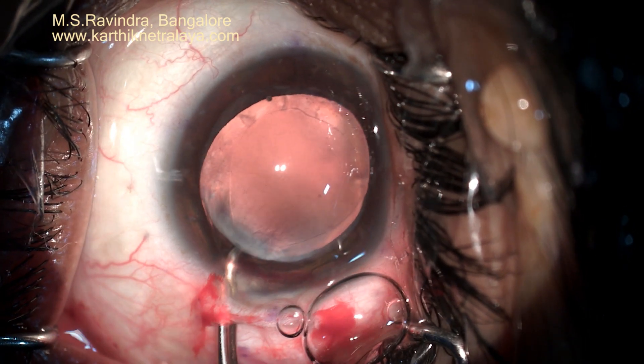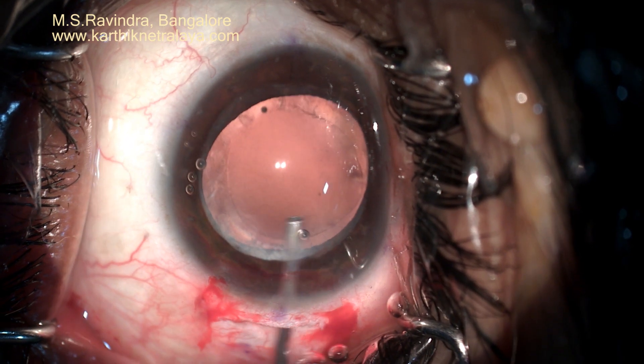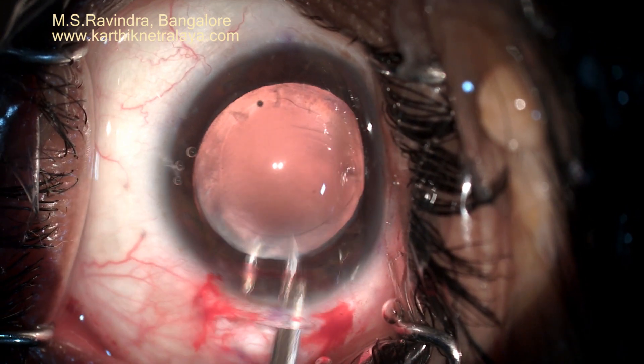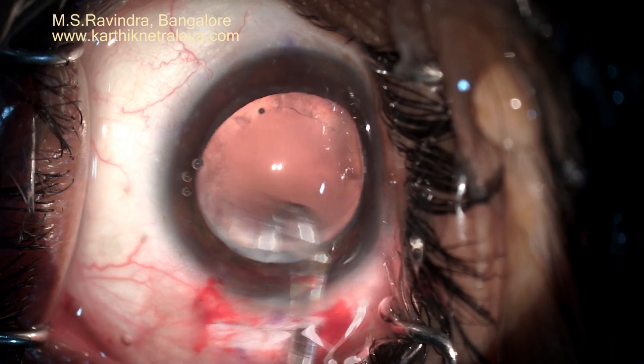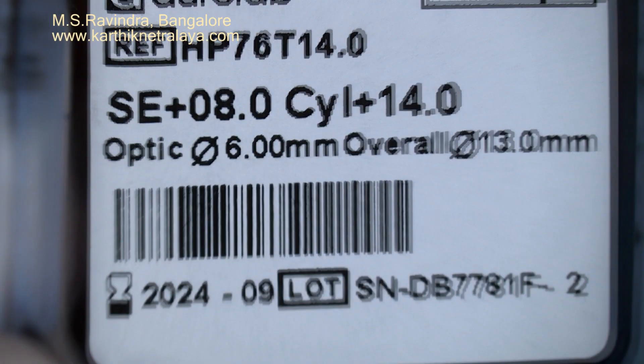Sub-incisional capsule can also be polished using J-shaped cannulas. Note that HPMC is being injected into the anterior chamber repeatedly so as to protect the endothelium.